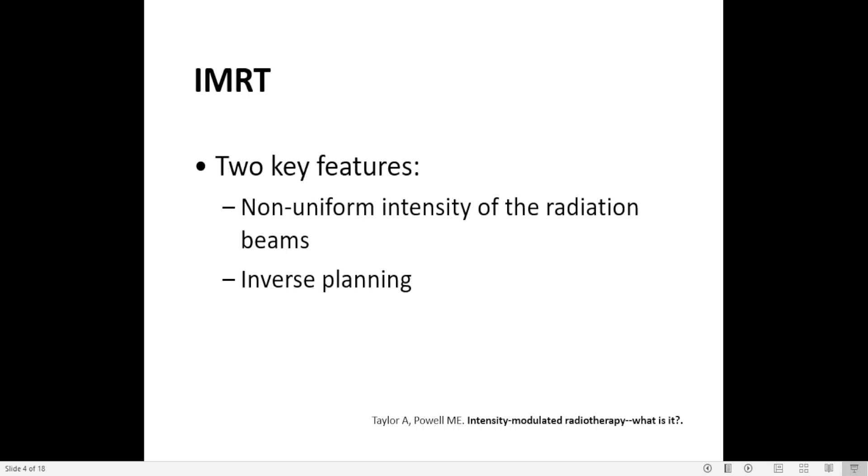Two key features are non-uniform intensity of the radiation beams and computer-based inverse planning.